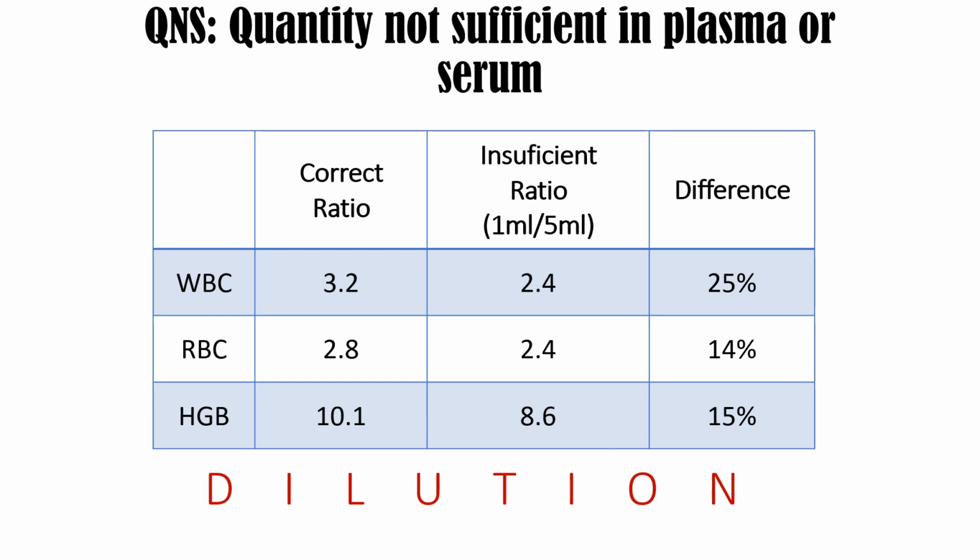The reason why we have to fill out the tube completely and up to the proper level is because of this, to prevent dilutional effect and to guarantee at least a normal average in blood test result for this patient.